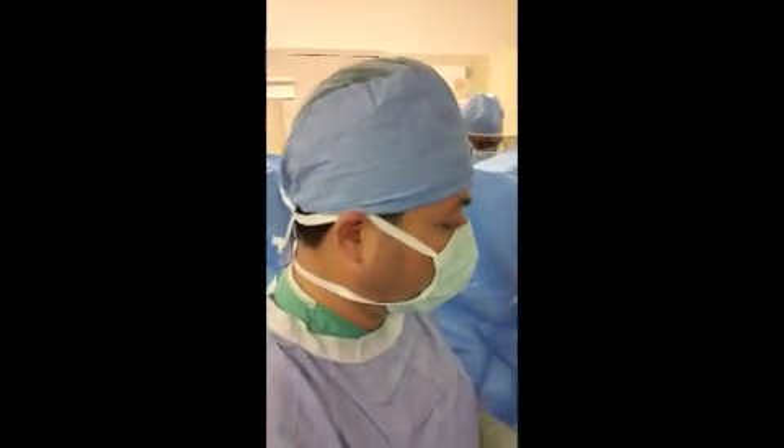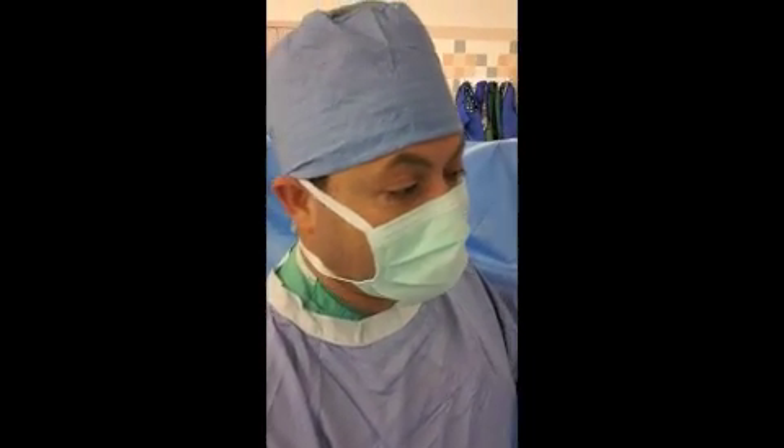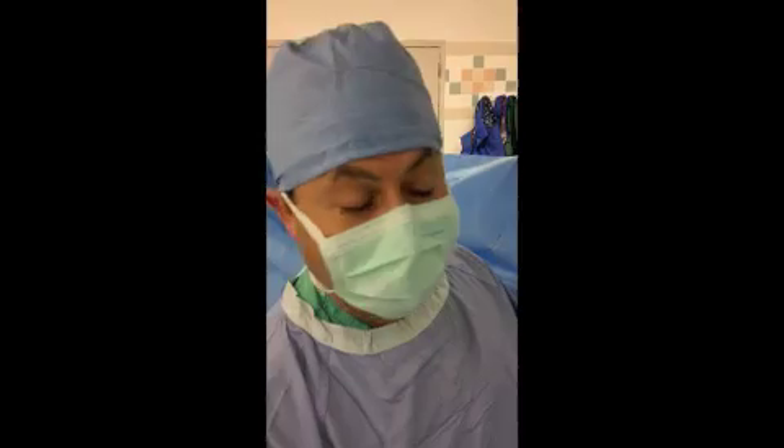Hi, this is Aetan Fikori, here to demonstrate the intra-articular injection, such as for glenohumeral joint reductions and for aspiration for septic joints.